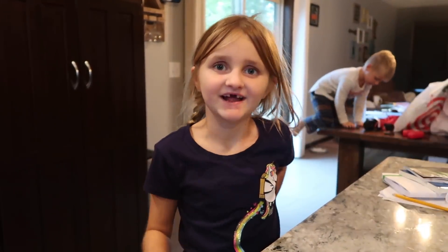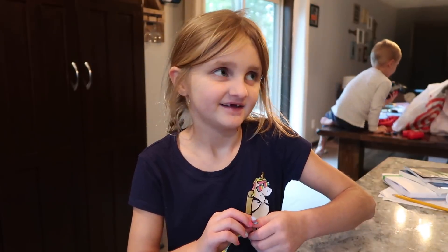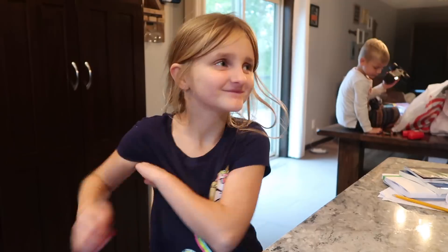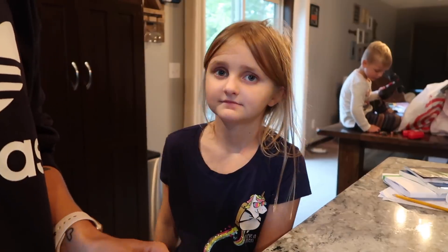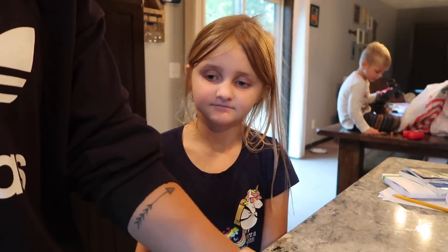We are doing a pod today. Where are we going to do it? On the back of my arm. We are going to try it on the back of the arm today. We already did it on the back of my arm. Oh yeah, you're right. I forgot. But you like your leg better. I don't want to do it on the back of my arm today.